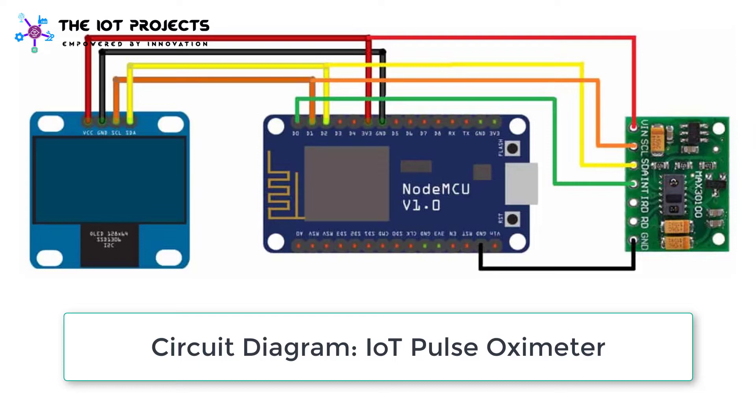Similarly, provide the 3.3V power supply through the VCC pin and ground the GND pin to the GND pin of the NodeMCU. You can follow this circuit diagram to make the connections.